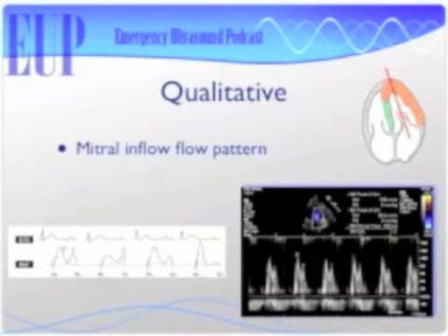All right. So here's an example of the E and the A wave. We can see that it initially starts off as normal. Over on the left-hand side of the screen there, you can see that the mitral valve flow is just below the EKG rhythm strips.